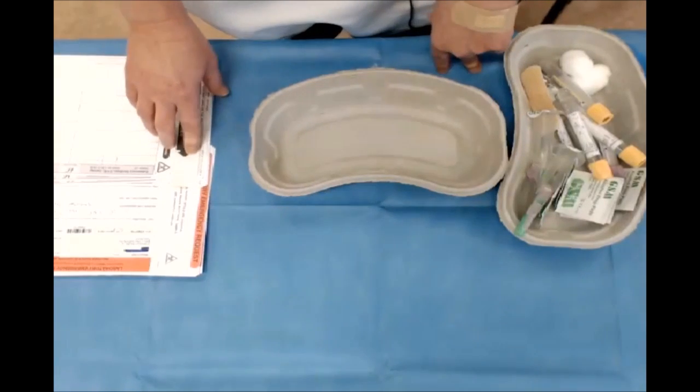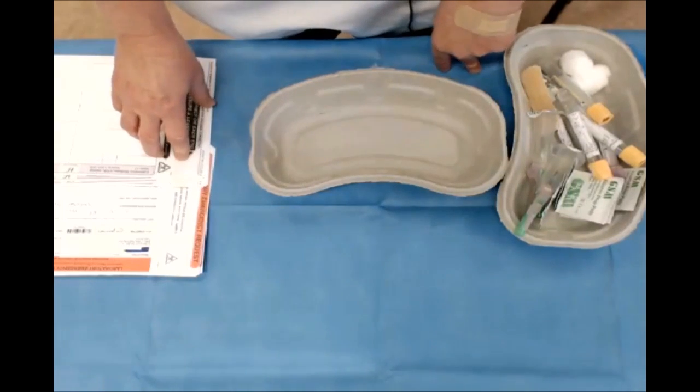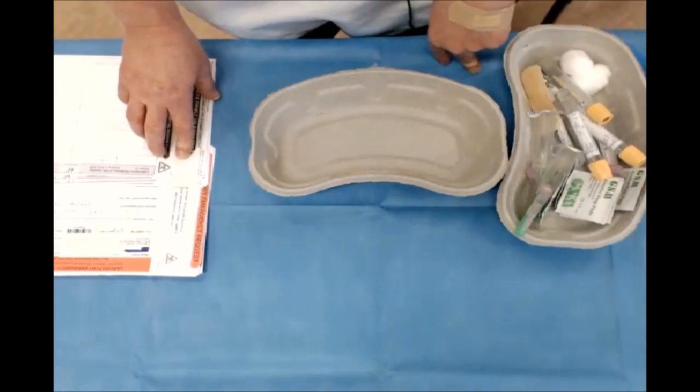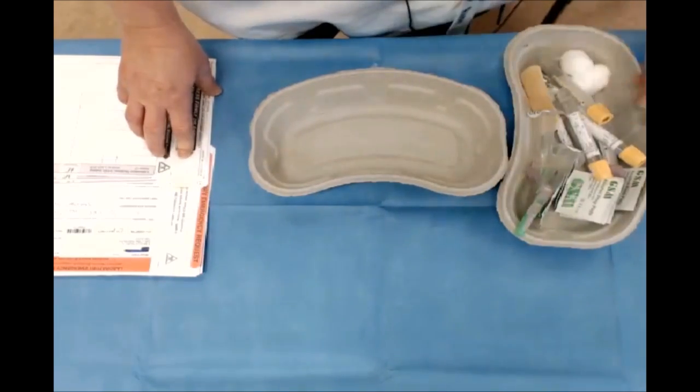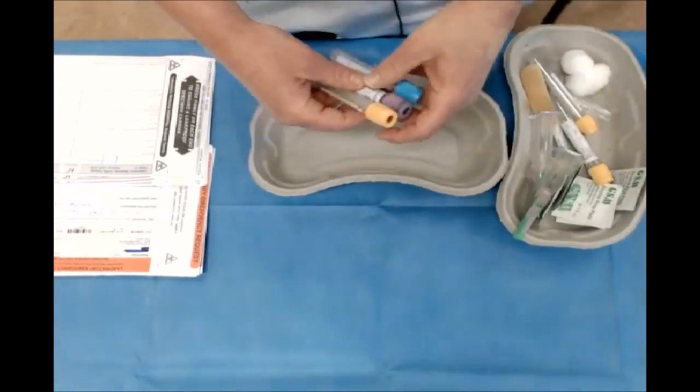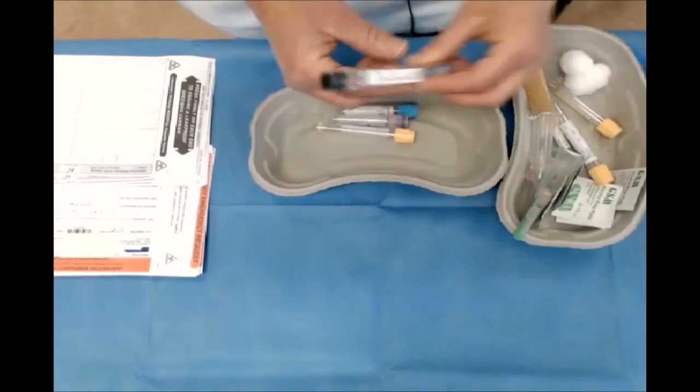I'm called to a patient's bedside to do a blood test. I check my laboratory requisition form and determine what blood tubes are required. For hematology, I need a B12 folate and ferritin, an FBC, a coagulation study, and an ESR.